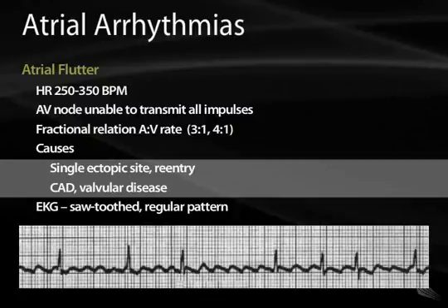You should be able to recognize atrial flutter on an electrocardiogram. It's very commonly tested, and usually the flutter waves occur at an interval of 200 milliseconds. And as you can see, these flutter waves are approximately one large EKG box across, and one large EKG box across is 200 milliseconds. If the flutter waves are closer together than that, it is most likely atrial fibrillation.